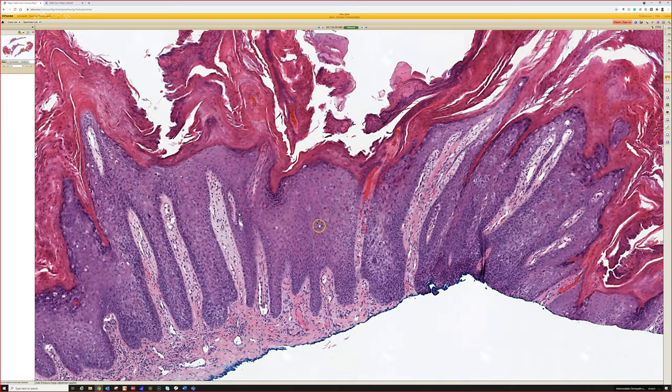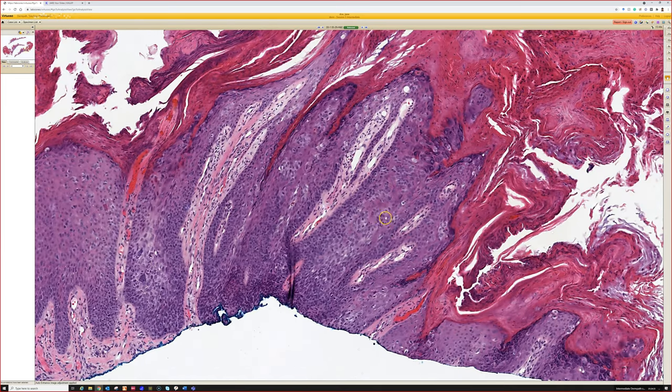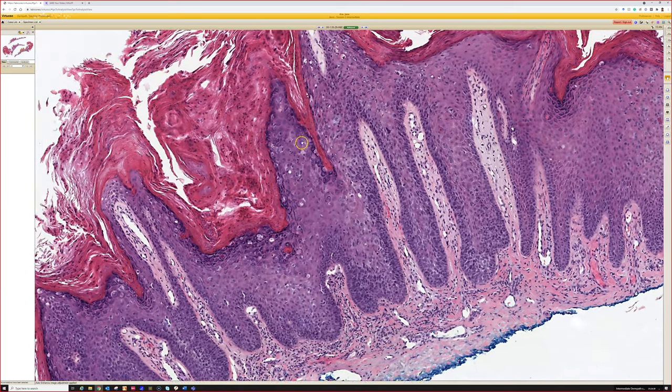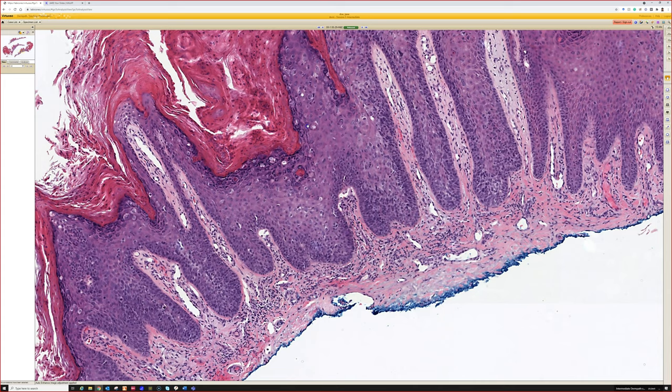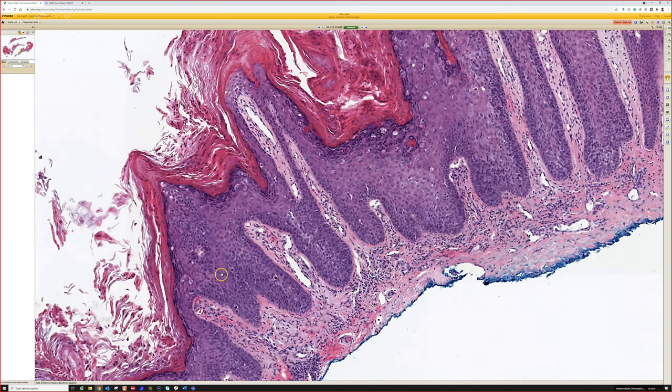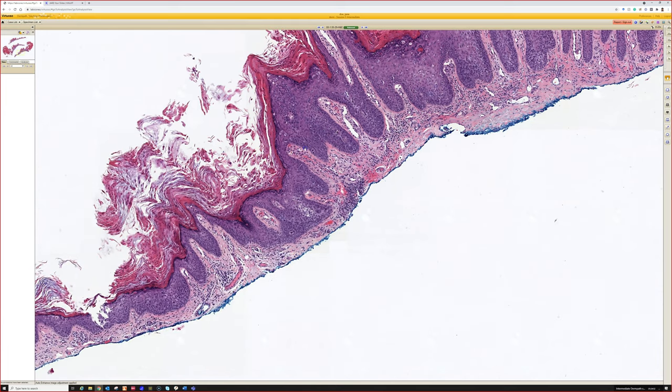What do you guys think? Yeah, this is squamous cell carcinoma in situ, Bowen's, that has lots of pagetoid spread, really abundant. Sometimes this one doesn't even really have very many areas of full thickness atypia, but if I see keratinocytes that are very atypical with pagetoid spread, I'll call that squamous cell carcinoma in situ based on the pagetoid spread of the keratinocytes, even if I don't find any definitive full thickness areas.